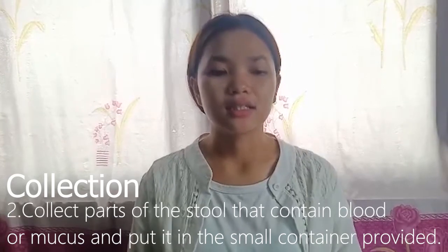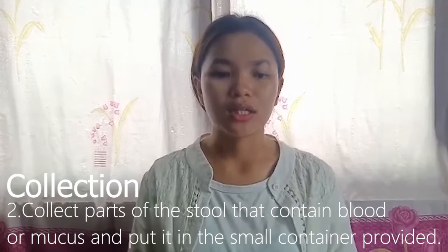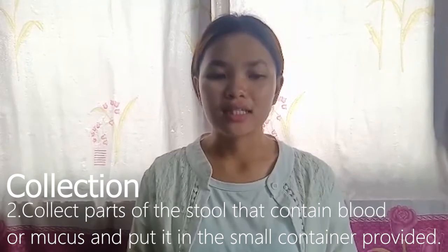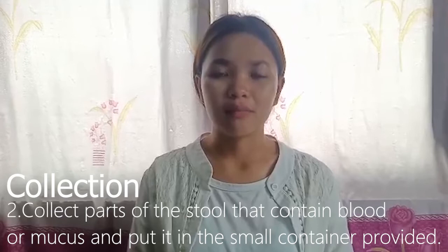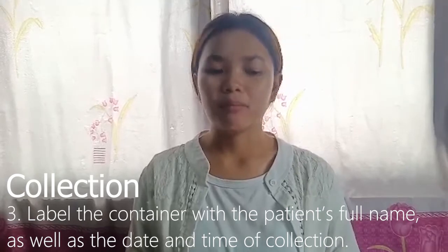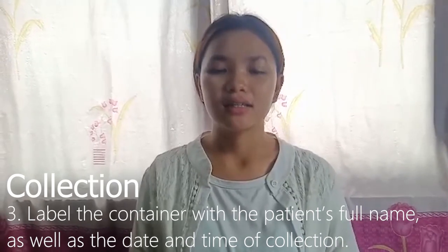Second is to collect parts of the stool that contain blood or mucus and put it in the small container provided. The sample should be at least peanut size or your thumbnail at most. And third is to label the container with the patient's full name as well as the date and the time of collection.